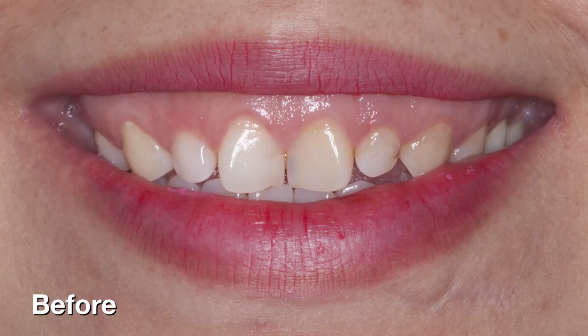In this next case, the patient was unhappy with her gummy smile, her teeth, and her facial profile. After carefully planning the solution to her problem with our in-house oral surgeon, Dr. Peter Scheer, her treatment included aesthetic crown lengthening by gingivectomy and ostectomy to reduce the amount of gingival display, and also genioplasty to correct her facial profile. After all options were presented, the patient also agreed to 10 prep veneers using our Obsidian Lithium Silicate Ceramic.